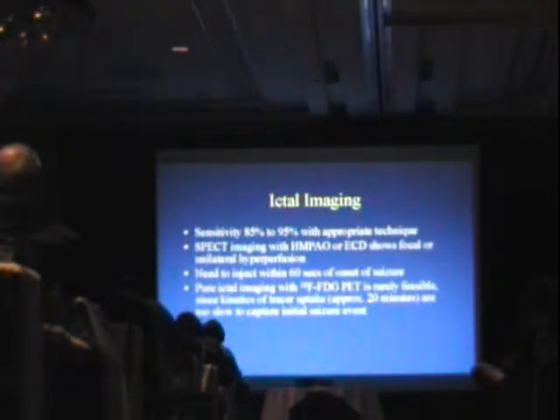So what we do is we make up a dose, have it up on the floor, and the patient's being monitored up there for a seizure. As soon as the alarm goes off, a nurse runs right in there and injects the tracer immediately. The patient can be imaged then at leisure, hours after that, because the tracer doesn't redistribute once it gets into the brain.